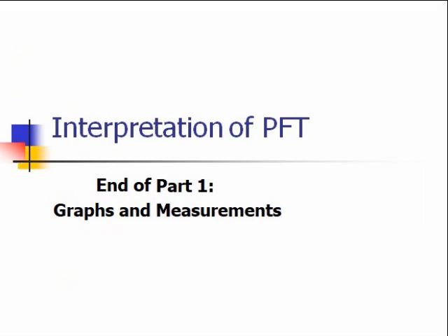Well, we're at the end of part 1, and hopefully you'll join me in part 2, because that is where I tell you how to use these 8 key measurements, what information you need to draw out for the actual interpretation of a pulmonary function report.